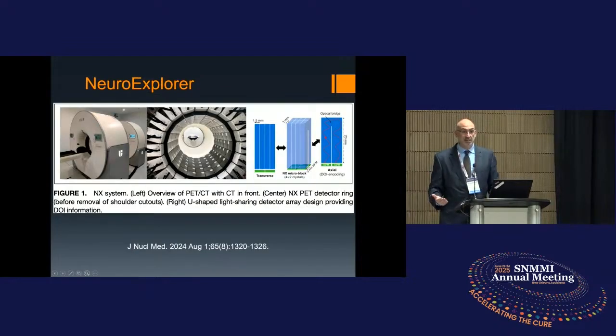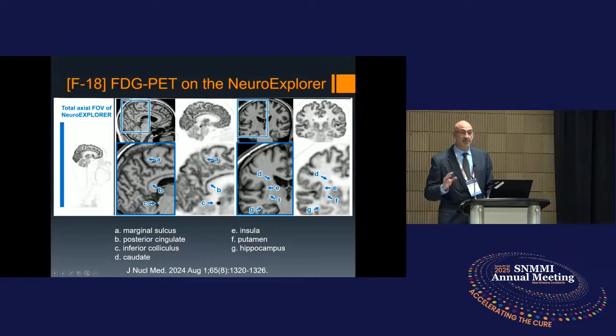On top of that, another thing you may not know about scanning technology, it has been a huge deal also in this society. Folks in collaboration with a company, and at Yale University, and also at University of California, I think Davis, have a collaboration to build one of these scanners, but specifically for the brain. And they are seeing details that they've never seen before of the human brain.